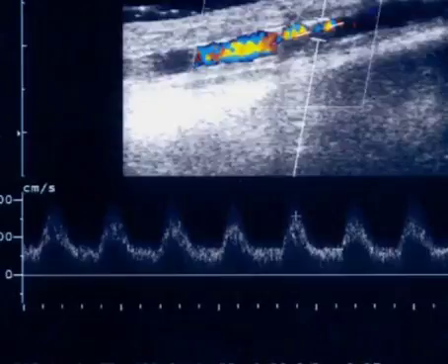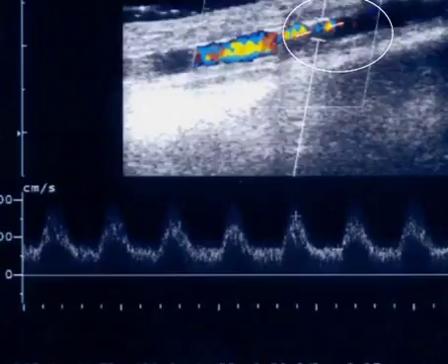Here's an example of a bypass stenosis. Now certainly we look up here and we see, wow, this color is in tough shape. There's a lot of aliasing going on. We see a lot of debris here on the grayscale. And as we listen to the flow coming towards us, we have velocities of about 300 centimeters per second.